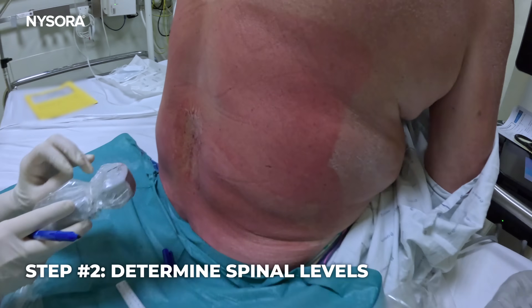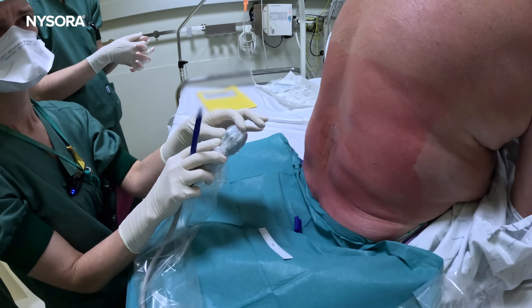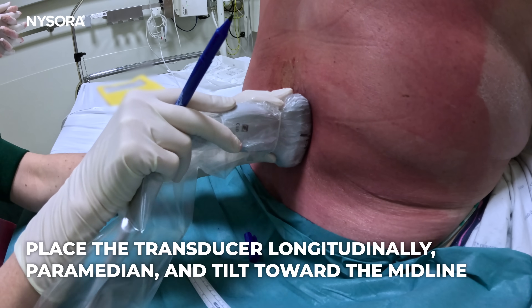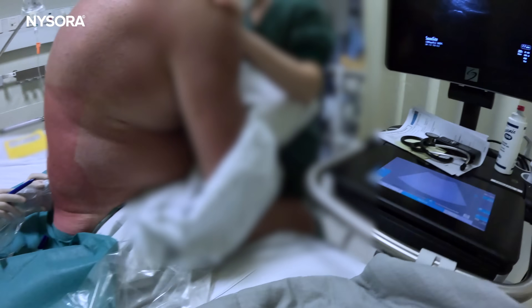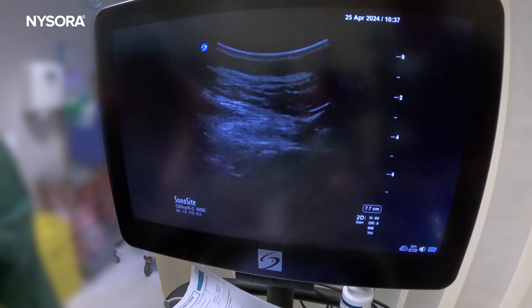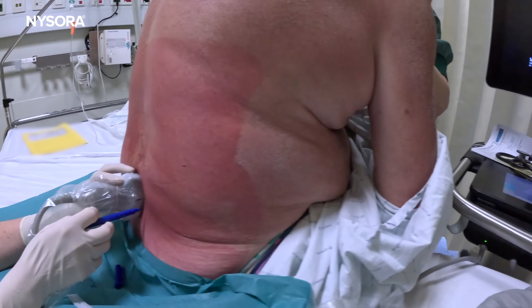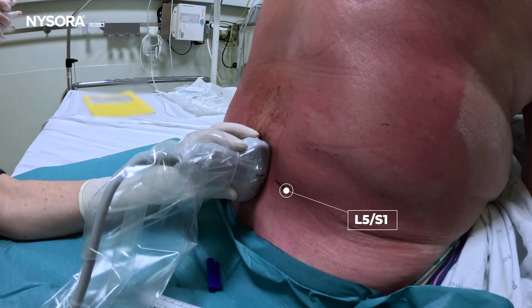The other thing we'll do is see where the sacrum is and L1. We place the transducer in a longitudinal way, just off the midline — so paramedian — and look a little bit towards the midline. We try to see the sacrum as a continuous line. Moving up, you see that first drop — that is L5-S1. We can put a line again in the middle of the transducer to mark L5-S1.